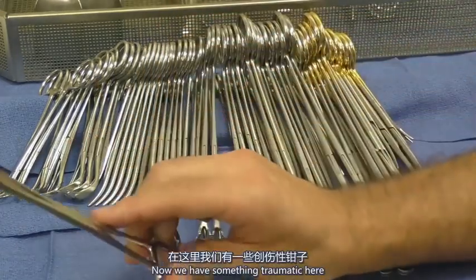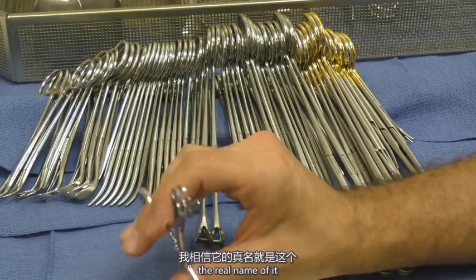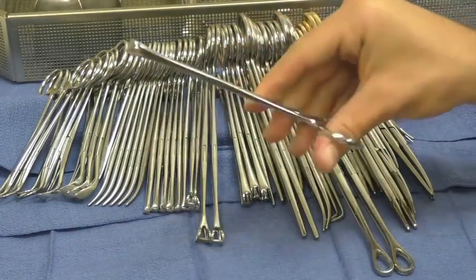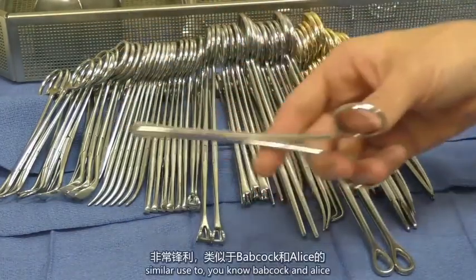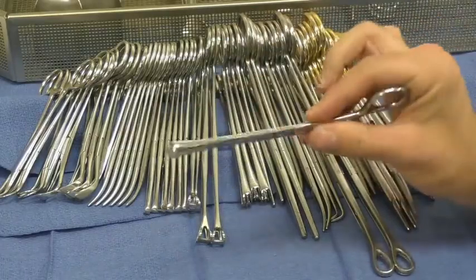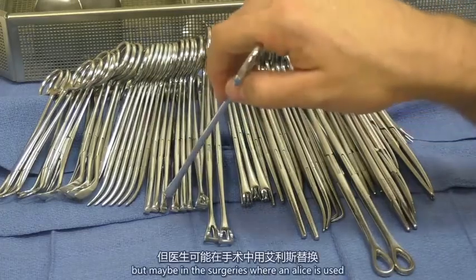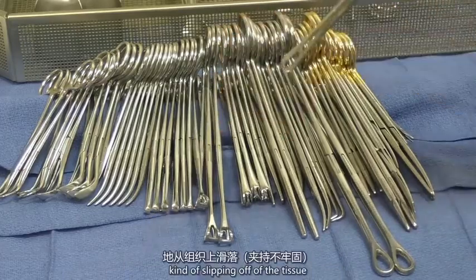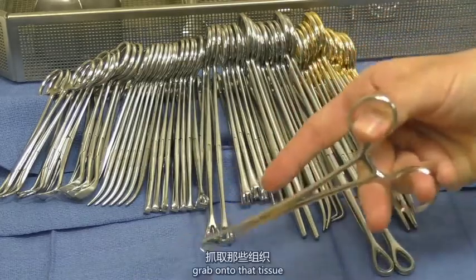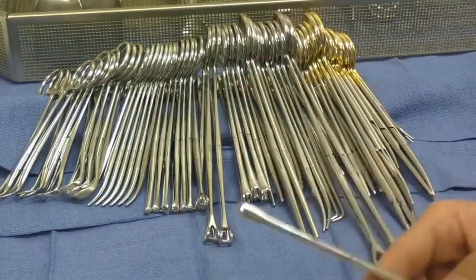Now we have something traumatic here. This is the Lahey clamp, or the Lahey goiter clamp, I believe is the real name of it. This clamp, obviously you can see it has teeth. It's very sharp. Similar use to Babcock and Allis, where it's going to be grabbing tissue and holding on to it. They will not use this on bowel like a Babcock would be used on, but maybe in surgeries where an Allis is used and the Allis just keeps slipping off of the tissue and it's not grasping on there properly, they might just ask for a Lahey so they could really grab onto that tissue and tug on it so they can get their full dissection in that they want to achieve.